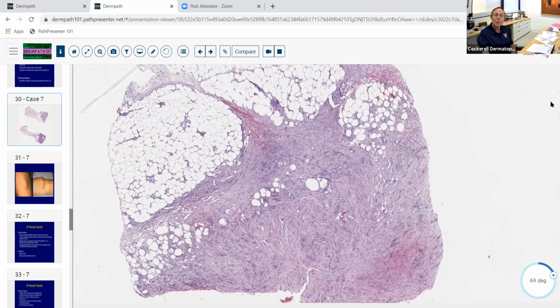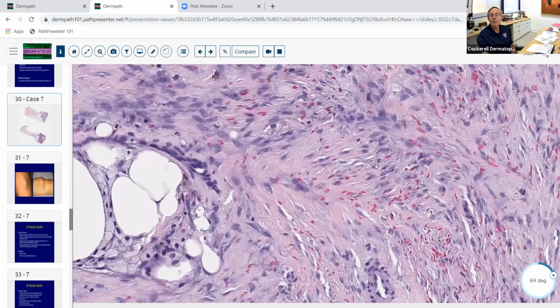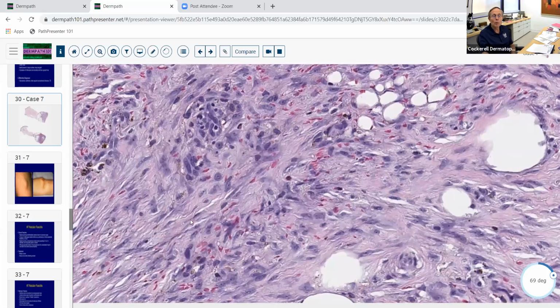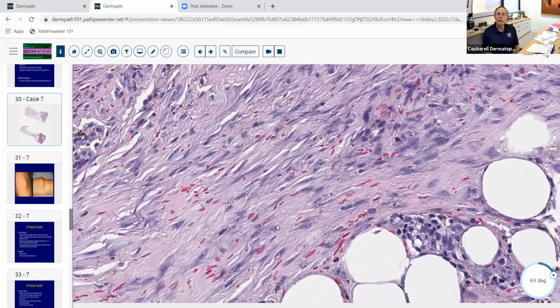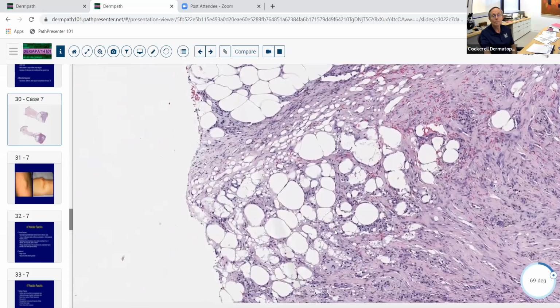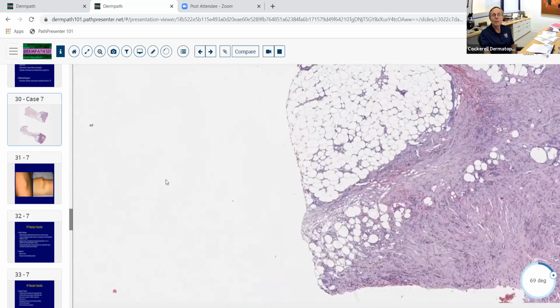But here we've got a nodular proliferation of spindle-shaped cells with a fibromucinous stroma. Probably the most important thing is that you don't want to overdiagnose something like this as a sarcoma. The other name for this is pseudosarcomatous fasciitis, because it can look like a sarcoma. The reason is that these cells proliferate, and whenever you get proliferating fibroblasts, you get mitotic figures, and they can sometimes look atypical and basically simulate a neoplasm.